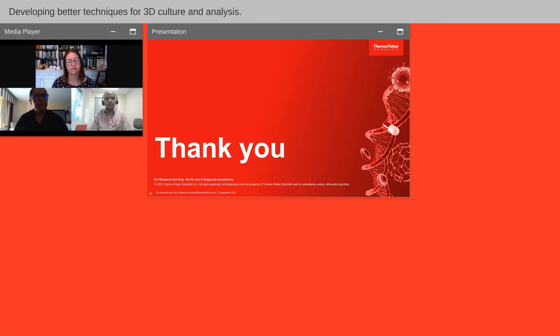Yeah, thank you. That's a great question. Geltrex is one type of what we call a naturally derived ECM, which is in this case a reduced growth factor basement membrane extract that comes from a mouse tumor. Within this matrix, it has different types of components: collagens, laminins, entactins, and other components that comprise this extracellular matrix. Geltrex also helps form an organized scaffold to provide structural support for your tissue, as well as offer functional input that will help modulate cellular function, helps with cell-to-cell communication and growth and development.